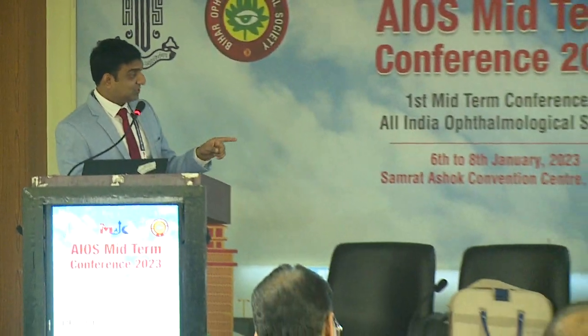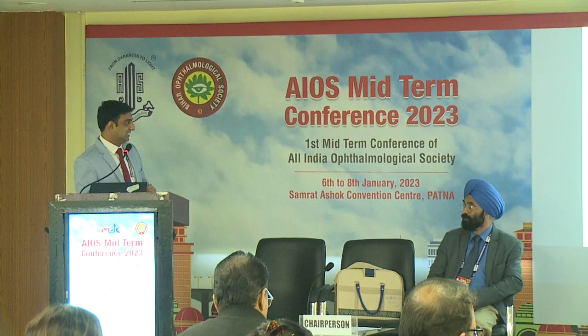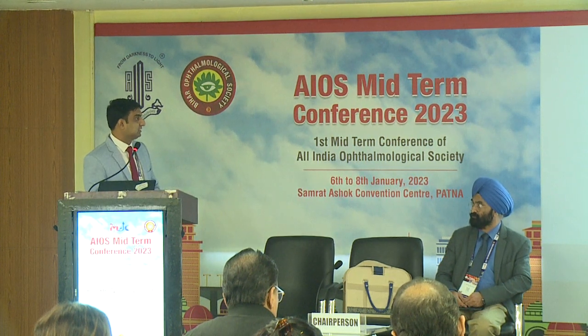Thank you very much. So Srinivas, in wet ARMD and geographic atrophy, there you are not going to recommend. Yes. And what about the patients who have a lot of soft drusen and pigmentary changes, do you think they are going to do well? Okay, I will not take them. That's why we have put it into the difficult counseling. They are not an absolute contraindication, but definitely it's better to watch those OCTs for a few years and then decide.